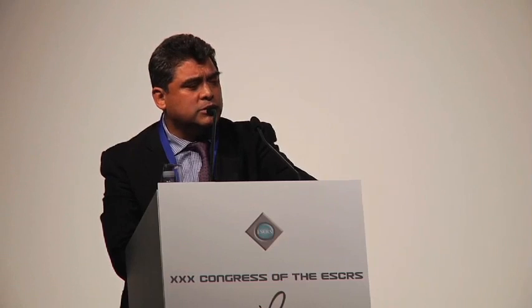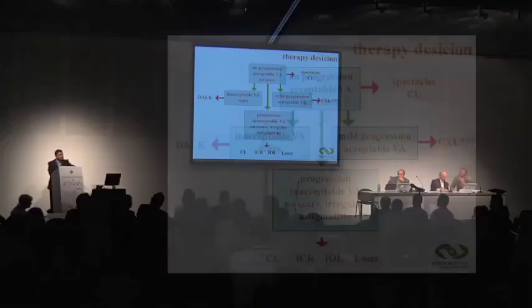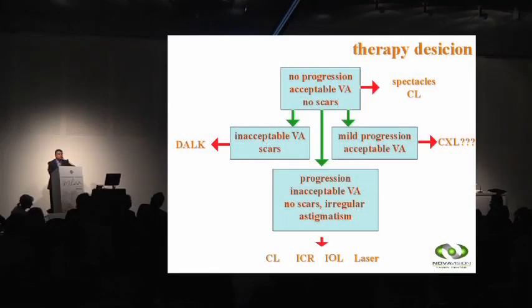Probably in the past, as pioneers in using the intracorneal rings, we knew that when we were using, for example, other kinds of rings, such as the Intacs, and we faced a patient with a -10 spherical component, we were only capable of treating 2 diopters, and those patients felt very unhappy because the residual myopia was -8 or -7.